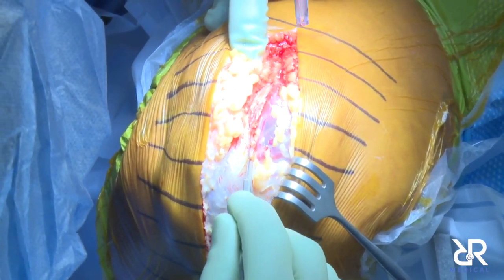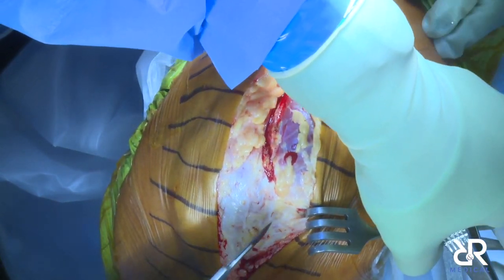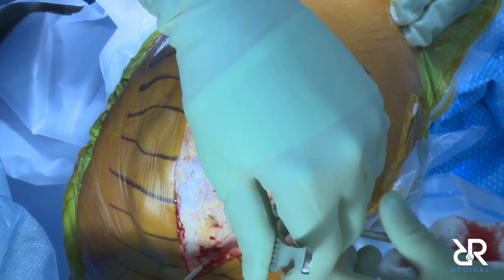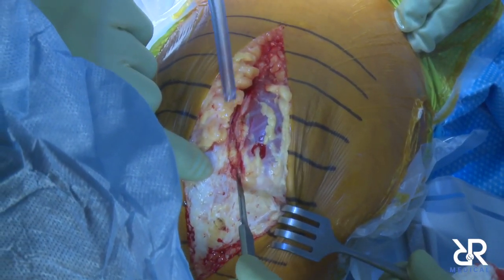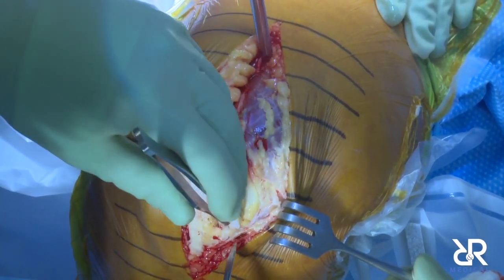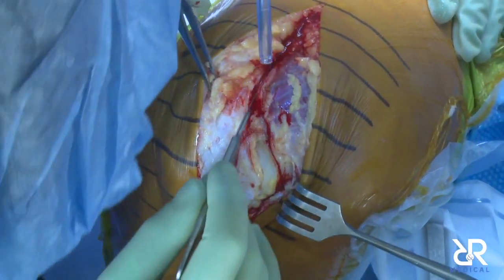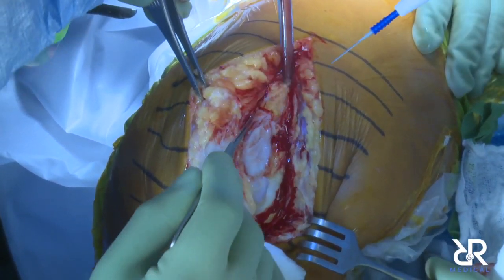So when we do these, we don't really try to minimize the incision. While I'm a firm believer in less invasive surgery on the hip side, doing an anterior approach, I'm not sure that small incisions on the knee have really proven to be of much benefit. In fact, the literature has shown that there's an increased risk of malpositioning.